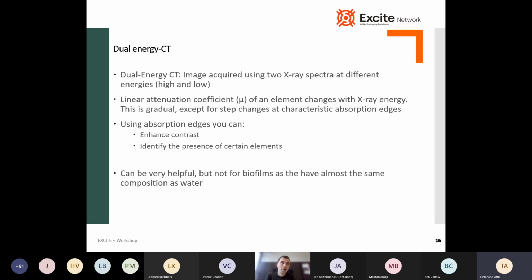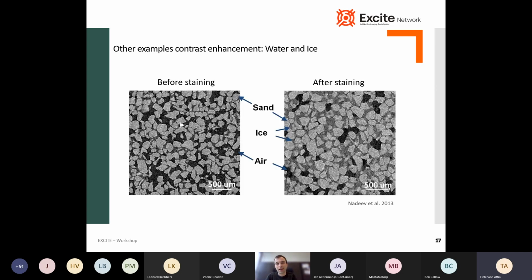Before I end, I will show you some other examples, so you don't think you can only do it with biofilm. The first one I want to show is something I found in a paper from Nadeev, who wanted to distinguish ice from air. So not water from air. Before staining, it was very hard with the setup to distinguish both phases. You can see the sand grains, but in between you don't see a difference between the ice and the air. However, after you stain the ice, it becomes much more visible and it will be much easier to do any kind of analysis on the data.